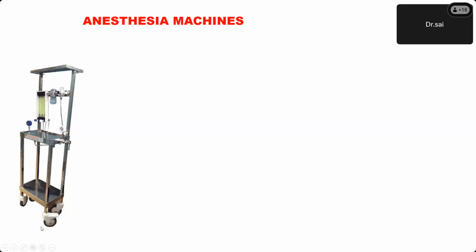And what about this wheel? What is this wheel called? It is called a caster wheel. Why do you call it a caster wheel? Anti-static. Does it mean caster wheel? Anti-static is for the rubber bush that is there in that wheel. But when you say any wheel is a caster wheel, it should be able to rotate on all 360 degrees.